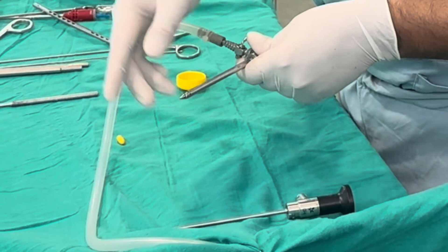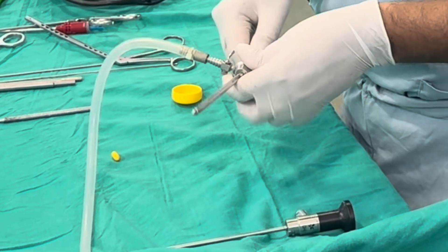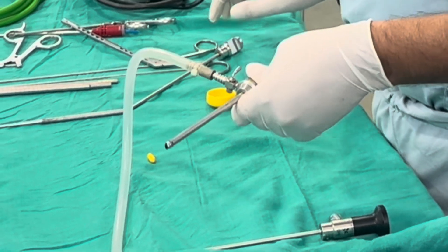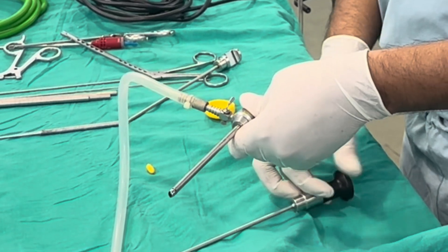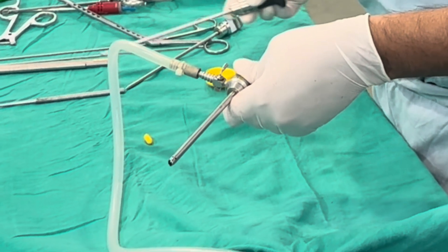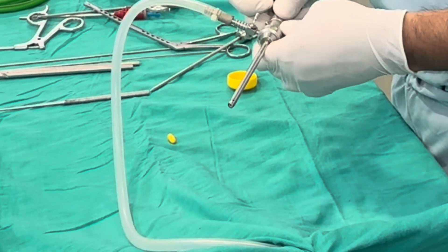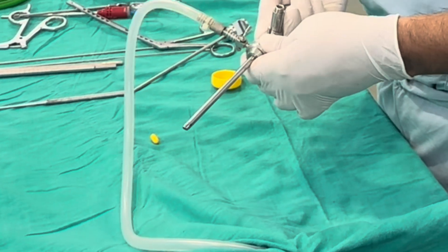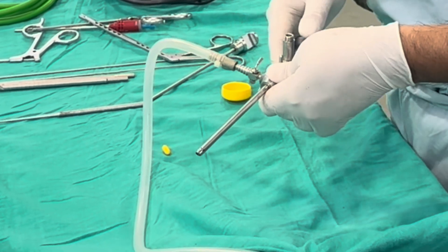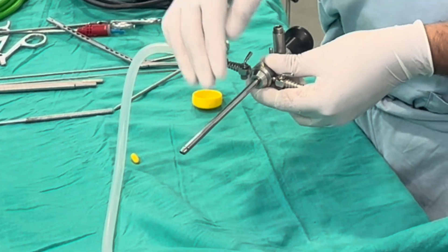This is a blunt trocar used to ensure we don't cause inadvertent injury to the knee joint and soft tissue structures. After putting the trocar in sheath and reaching the right spot, we take out the trocar and put the scope inside. The scope is locked into place — this is the Smith and Nephew scope along with trocar in sheath.